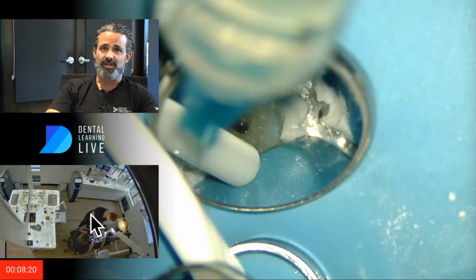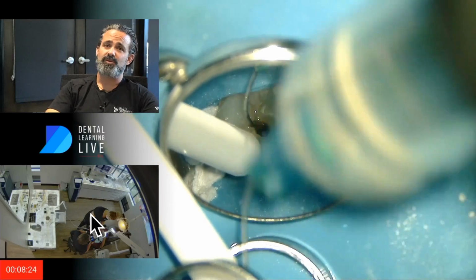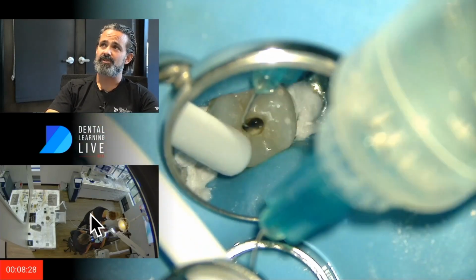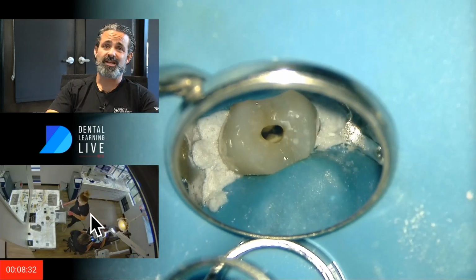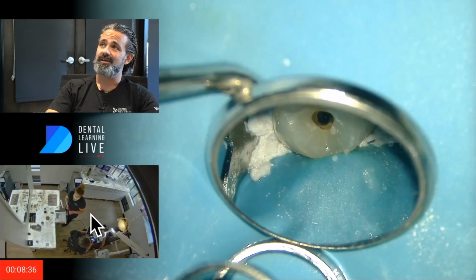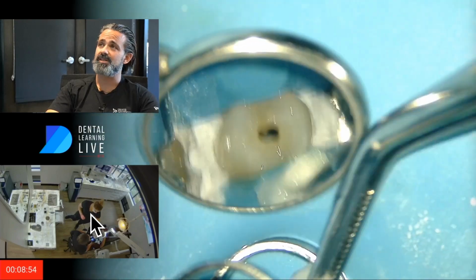I like the 3D shaper. I do think mechanically it gets into interproximal or isthmus type areas. I'm just going to flush that out, and that's that. So all I've used is an SX, is Discovery, and then a 3D shaper down to that apex locator length, which was also confirmed on the CBCT.